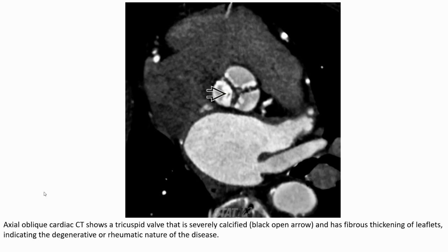This axial oblique cardiac CT shows a tricuspid valve that is severely calcified, and fibrous thickening of the leaflets, indicating the degenerative or rheumatic nature of the disease.